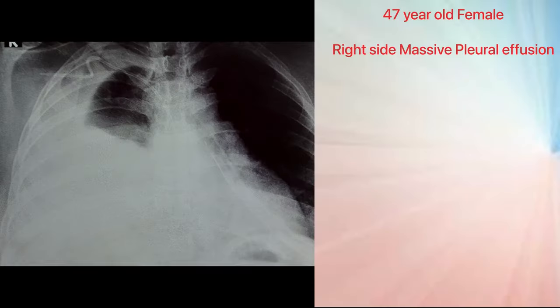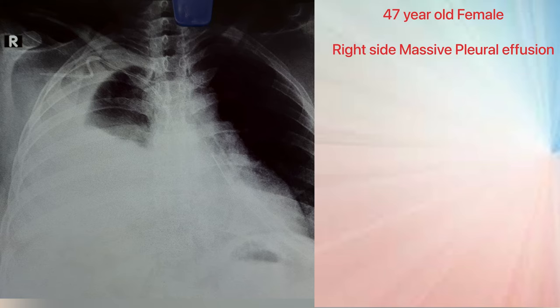Now we will see the procedure in a patient. This is our case — a 47-year-old female who came with right-side massive pleural effusion, and this was a diagnosed case of malignancy. We have decided to insert a pigtail catheter instead of a conventional ICD.